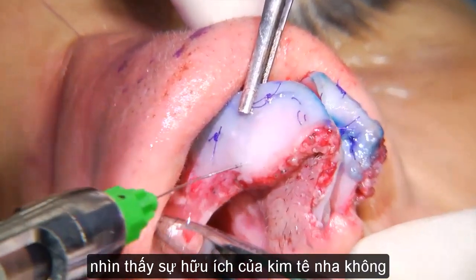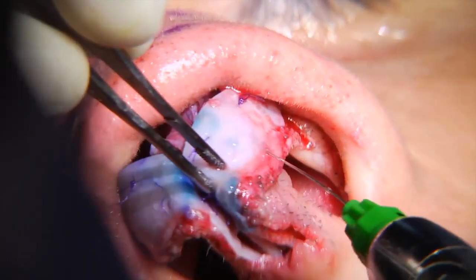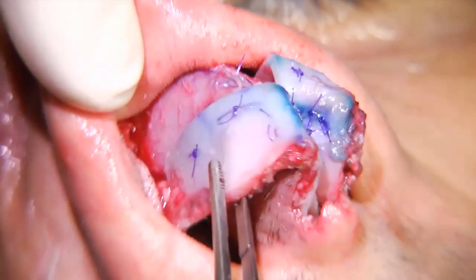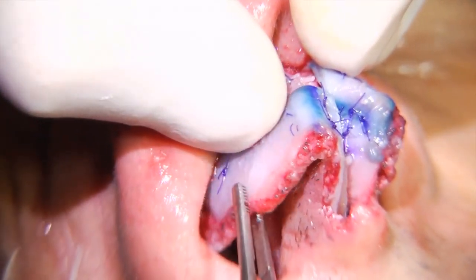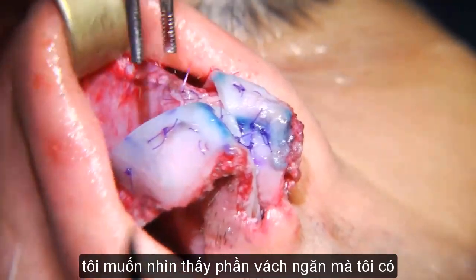See the use of the dental syringe? I like it very much. Nuova lama. Grazie. I want to see the septum I have.